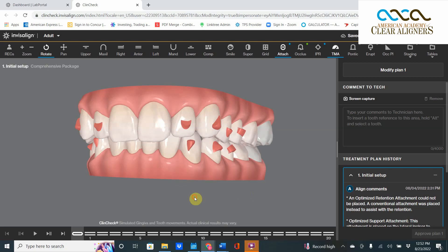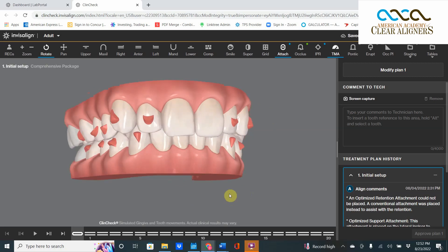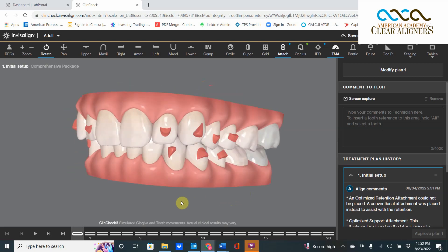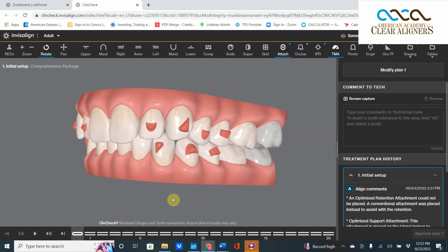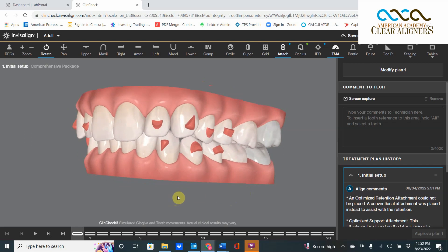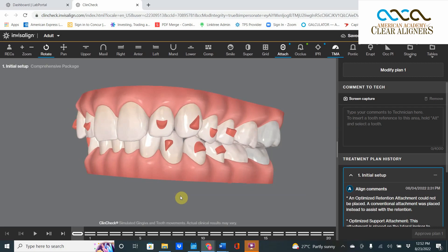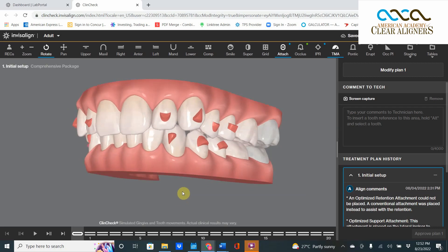You see, at the end of the treatment, we want the premolar occlusion to look the same or better than the original one. But a lot of times because of intra-arch alignment, I see the end-stage occlusion on the premolar is not as good as the original. So let's take a look at this case. You got a first bicuspid occlusion here, not ideal. There's a little bit of space, but look what happens in the ClinCheck.